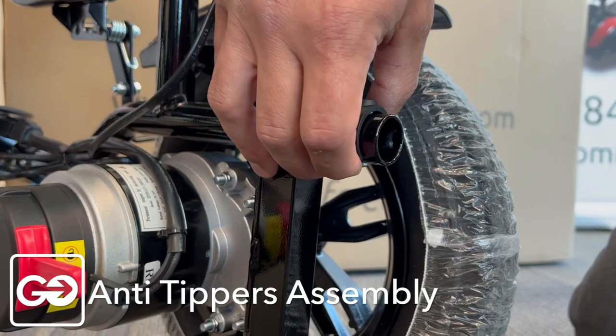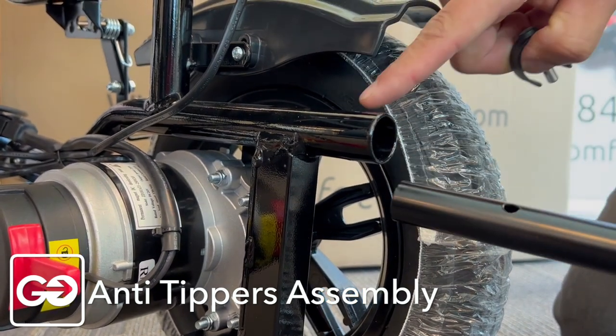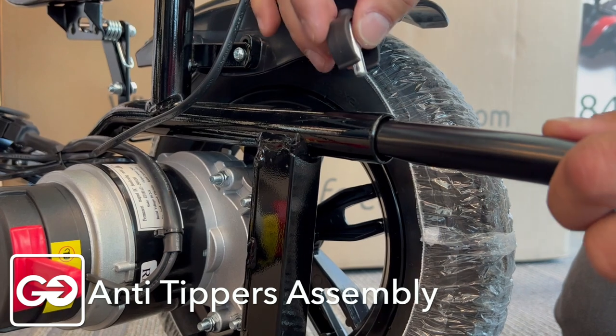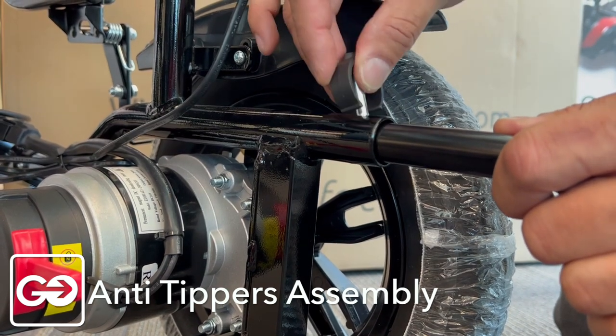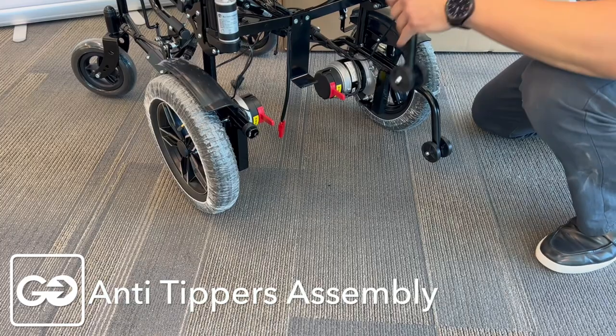We're going to give a little bit of a squeeze here and pull this up. You're going to notice the bar goes up and we're going to match this hole up to the hole in the bar. Push it in nice and softly, match it up, get our pin and push it right back in. Then just repeat that for the left side.